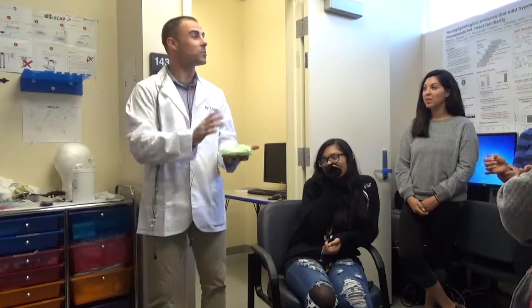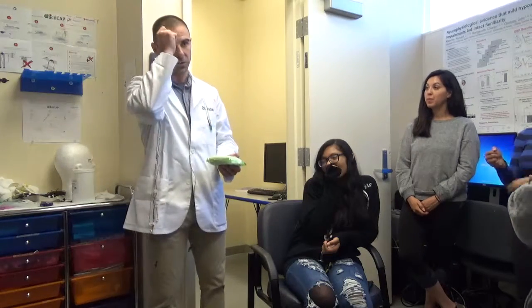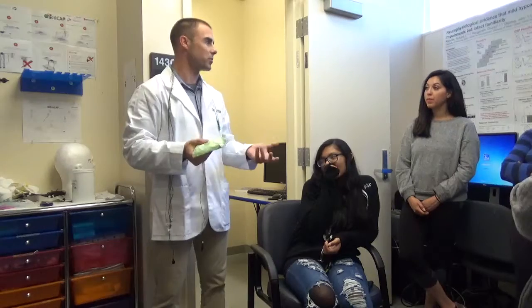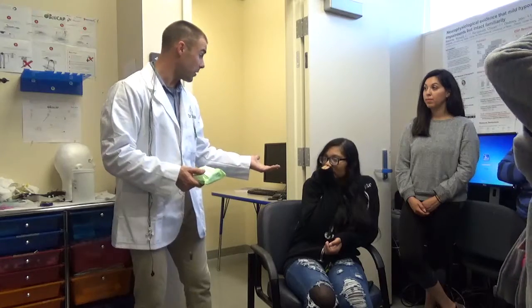So we have these wonderful new pieces of equipment, and that's essentially the same thing. It's a wipe that you clean off the site of where you're going to attach those electrodes, and you explain that to them. So this is all in the context of explaining informed consent, because they need to know. They need to know, why are you doing this thing by my eyeball, right? Especially, and sometimes if it's a guy or a lady who doesn't have makeup, right?